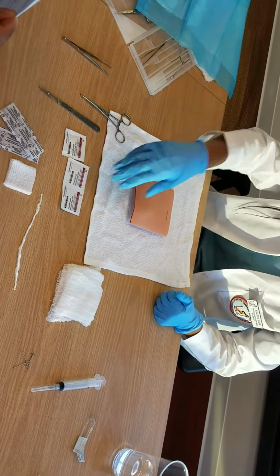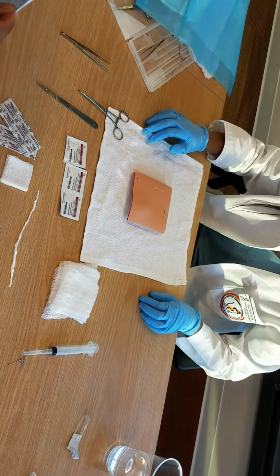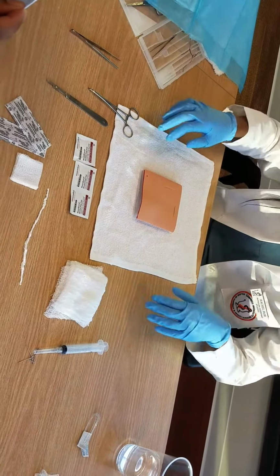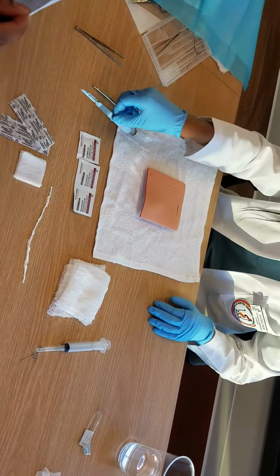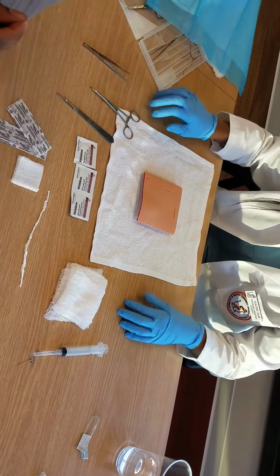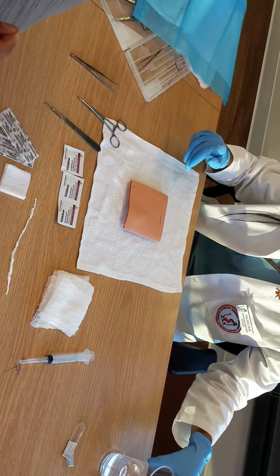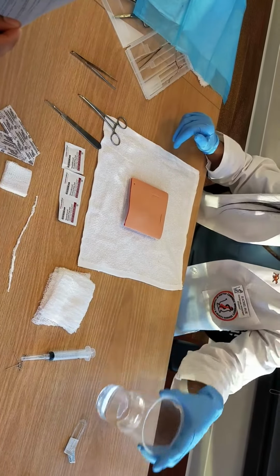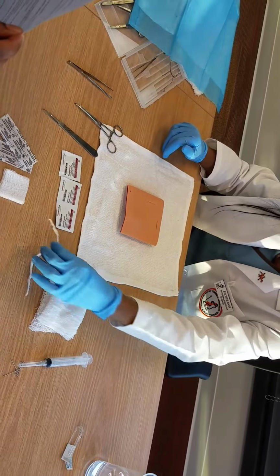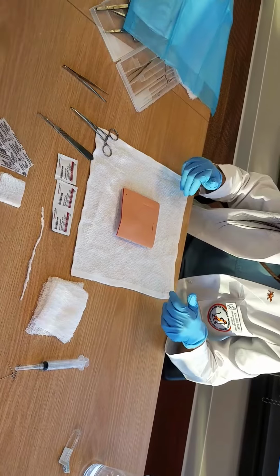Okay, so you want to make sure you have your alcohol wipes, 1 or 2% lidocaine without epinephrine, a 19 to 22 gauge needle, 4 towels for drapes, a number 11 or number 15 scalpel blade and the scalpel handle, Kelly clamps, Adson forceps, curved hemostats, 4x4 inch gauze pads, sterile gloves, 500 mLs of normal saline solution. You want some gauze strip to pack the wound, bandage, scissors, and dressing of choice to cover the wound.